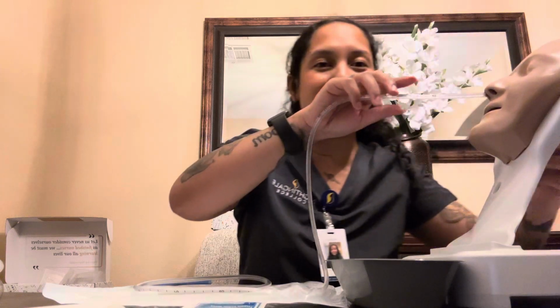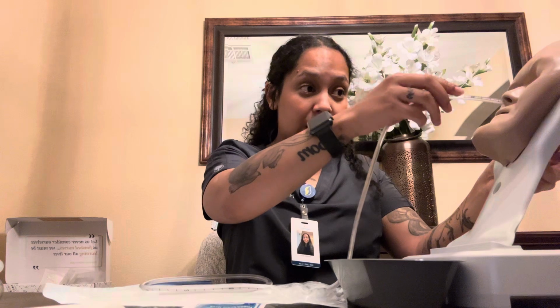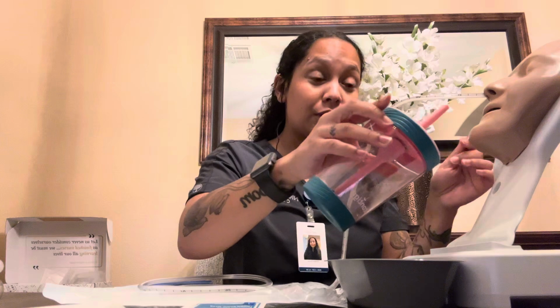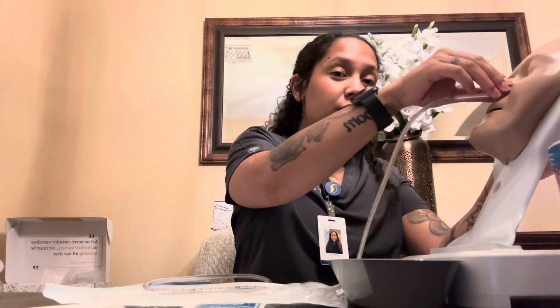Okay, I see it. Little by little. And then as soon as she gets any kind of gag, I'm gonna have her look down. And then I find it easier during that time when she feels a little bit of a gag, I'm gonna have her take a few sips of water. And then with each sip, I'm gonna put it in about 2 inches further. So she's drinking.